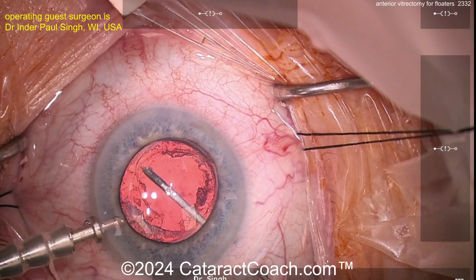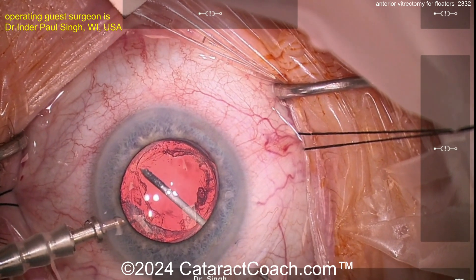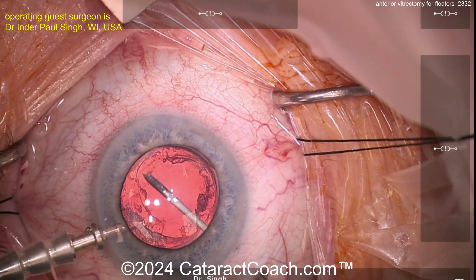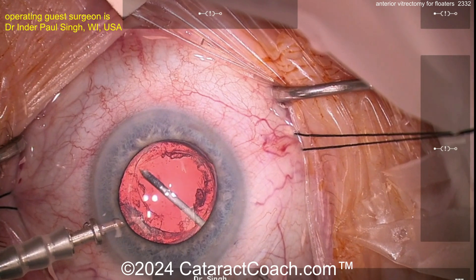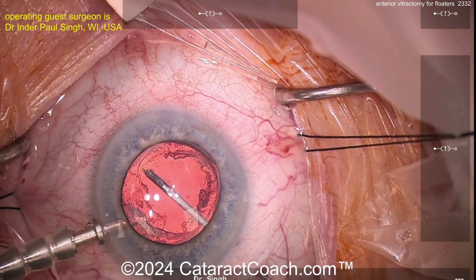Depending on your phaco machine, anywhere from 5,000 to 10,000 cuts per minute. We're staying in the middle of the eye — I'm not moving it around, not swirling around, just staying in the middle letting things come to me, which puts potentially less traction on the retina.